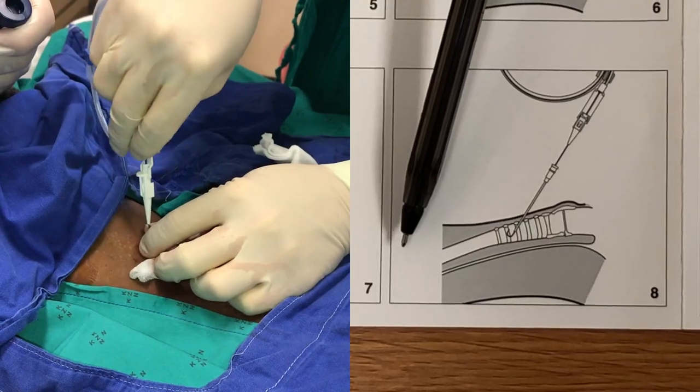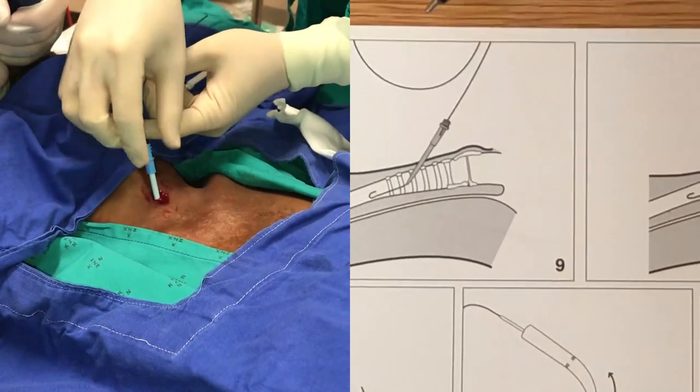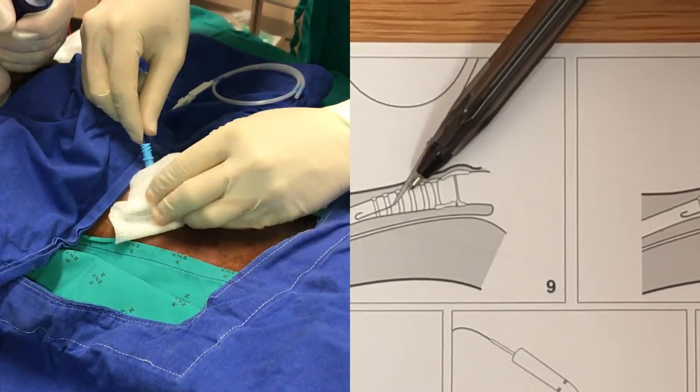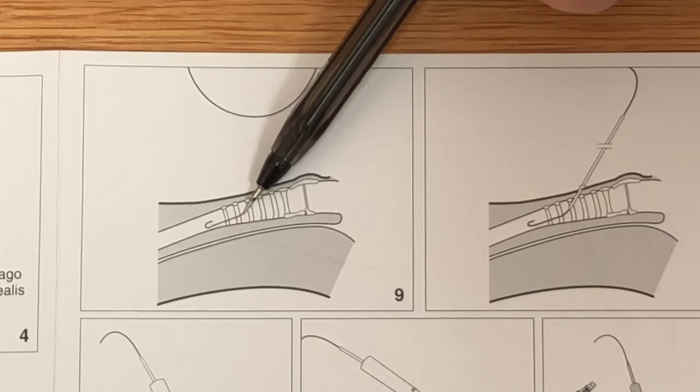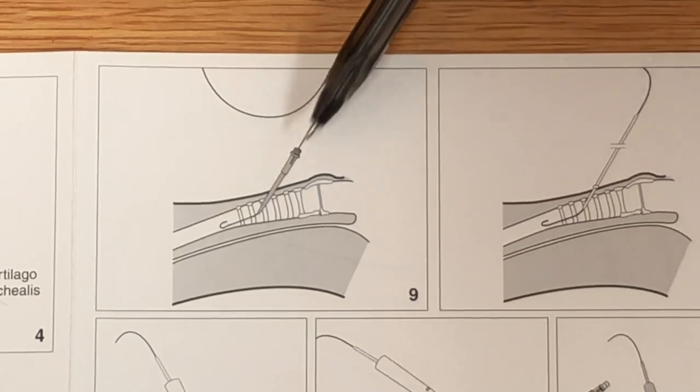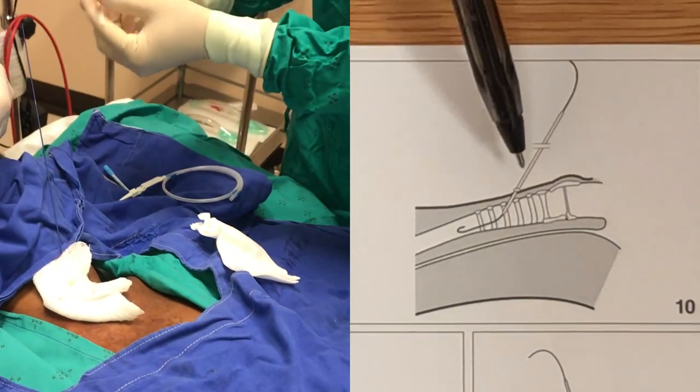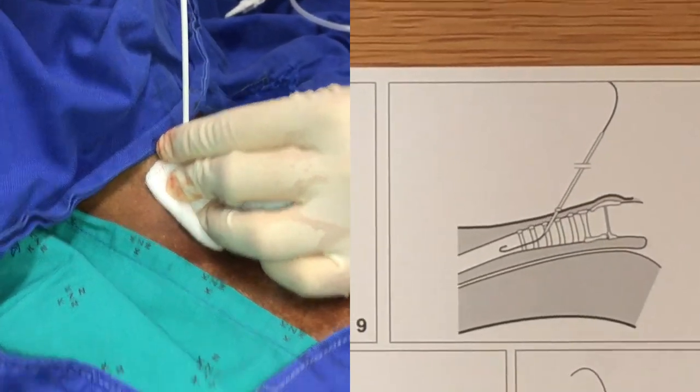Then over the guide wire put in the first stage dilator, introduced at about a 30 degree angle. Ensure that you have the shoulder of the first stage dilator within the trachea. If you have a bronchoscope available you can confirm this. It is always good clinical practice to check that the guide wire is still freely movable; that implies that it is not kinked. Once the first stage dilator has been placed, put the white guide wire protector over the guide wire until you reach the little elevated ridge at the skin. Then remove the first stage dilator.